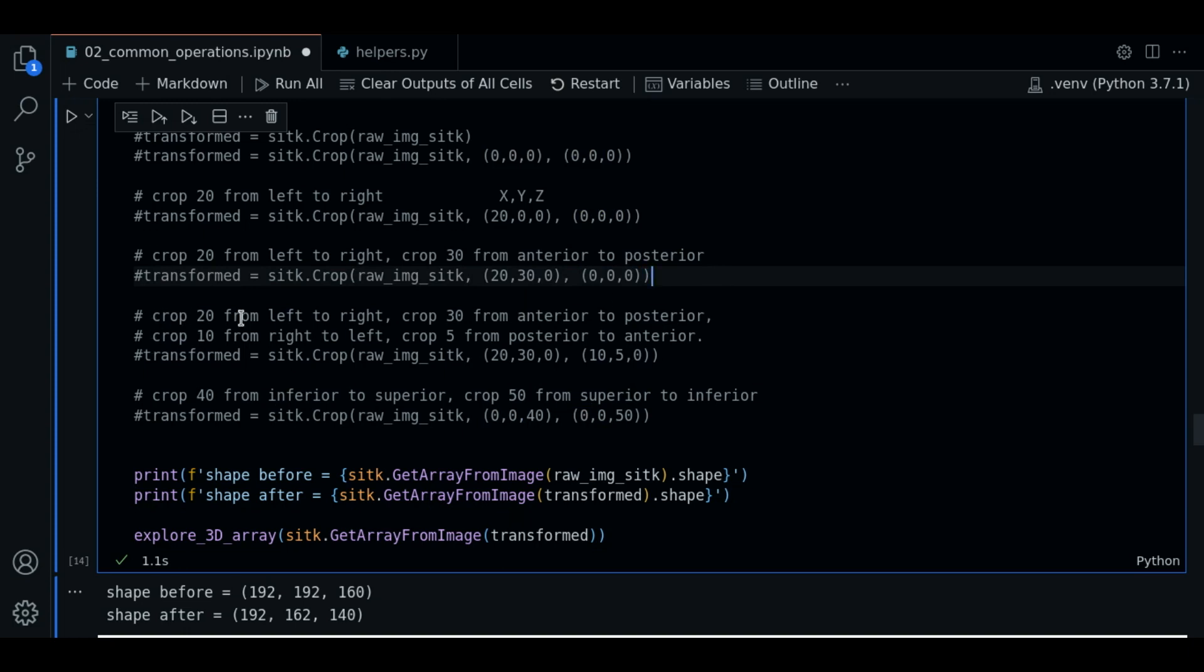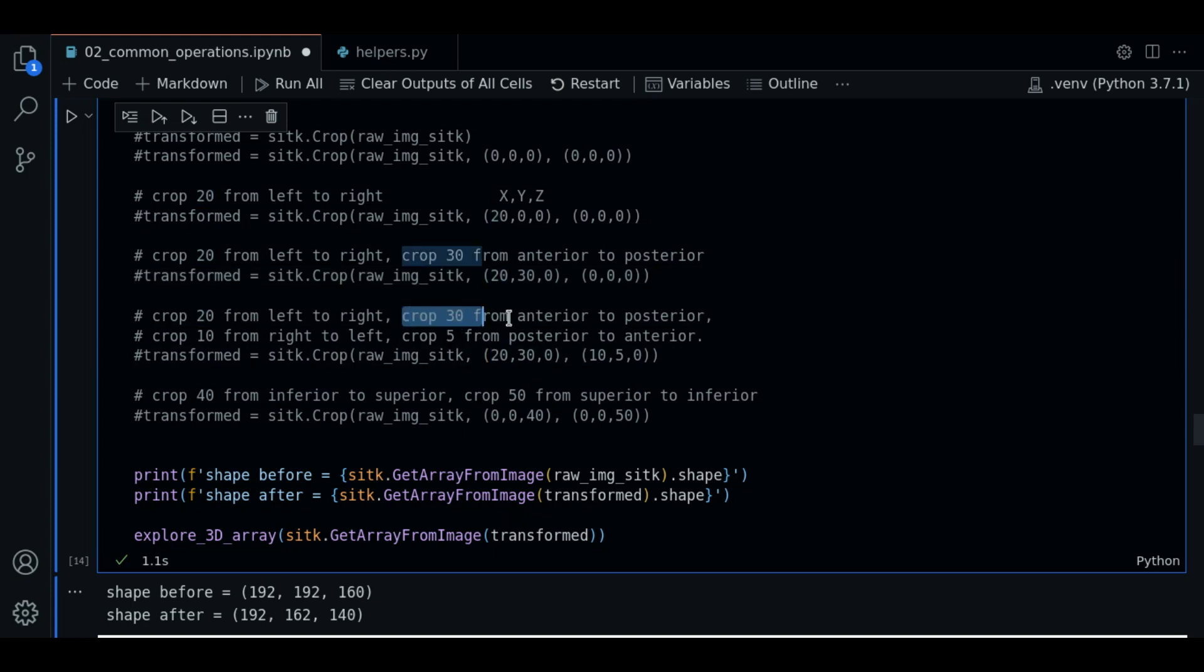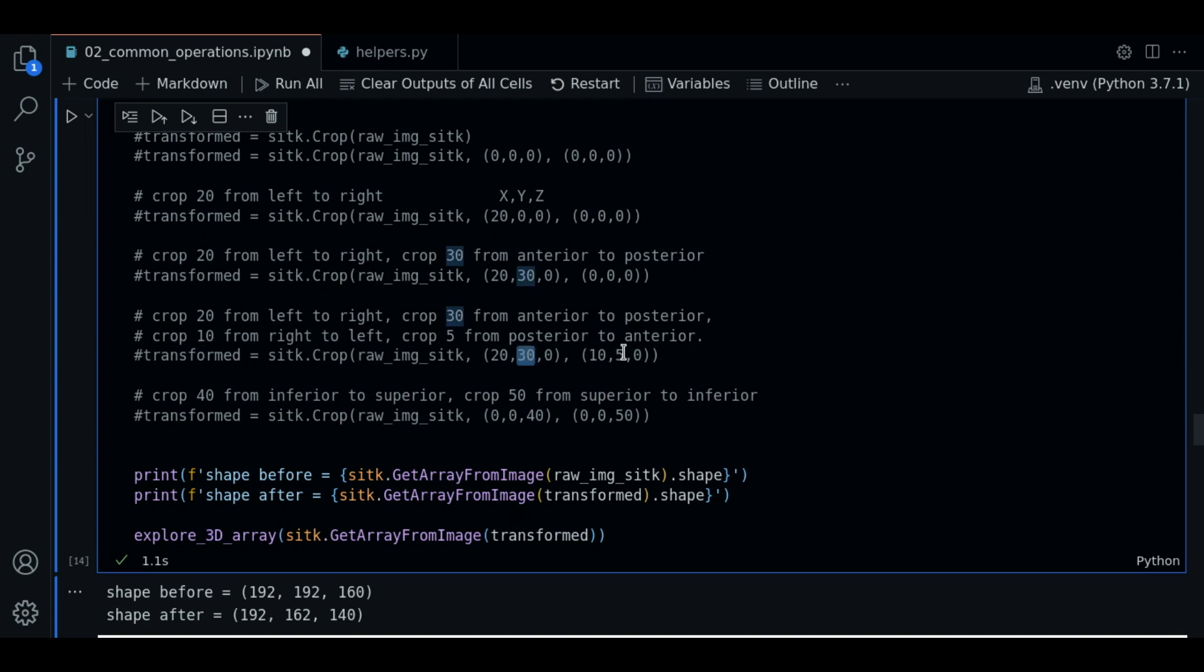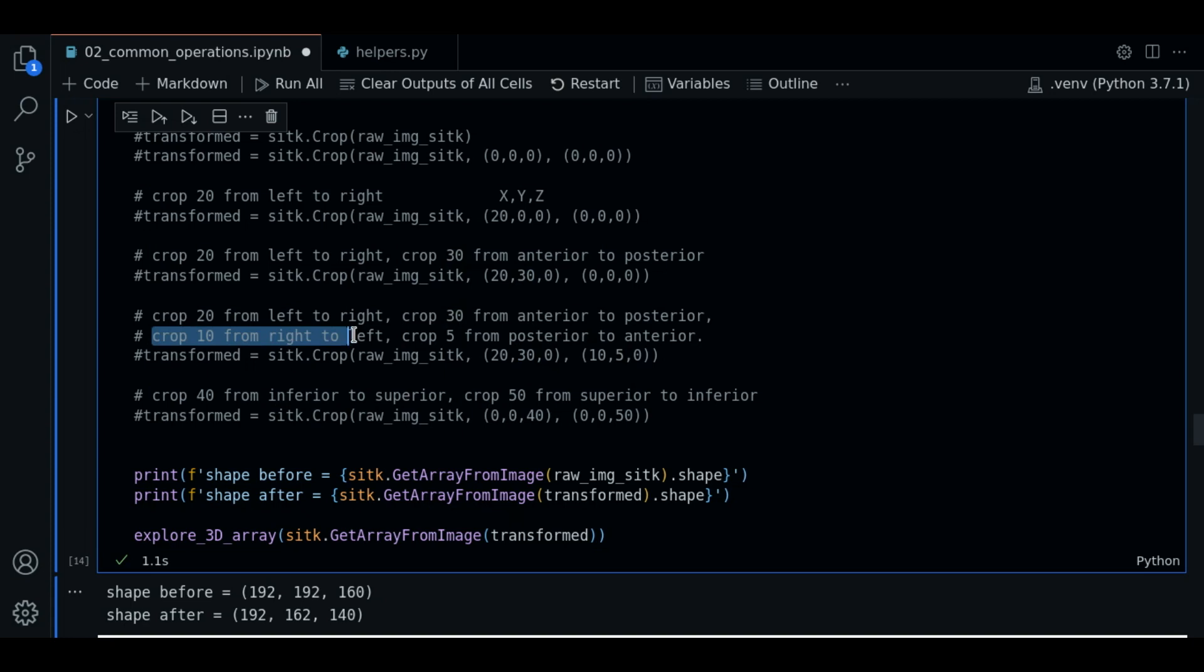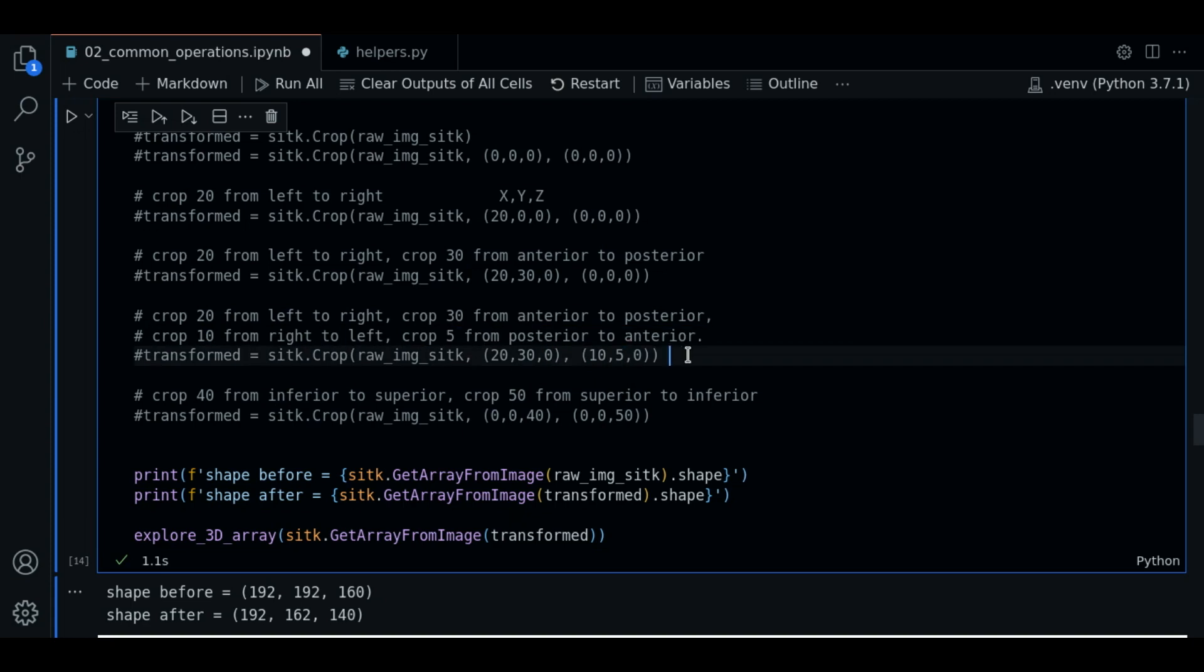Now let's crop 20 units from left to right and 30 units from anterior to posterior. And now with the addition of an upper boundary vector 10 units from right to left which is here and 5 units from posterior to anterior.